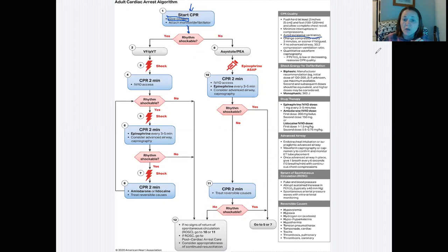When you hook up an ambu bag, you're going to go ahead and crank that oxygen all the way up, okay? All the way up. Another thing, you're not going to leave that mask on their face. You give them their 2 breaths, 30 to 2, look for chest rise. You want to confirm you're getting chest rise, but you don't want to squeeze that bag all the way to where it's an overventilation. You're going to build up air in the stomach and can cause damage that way.